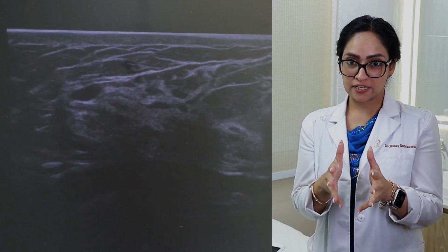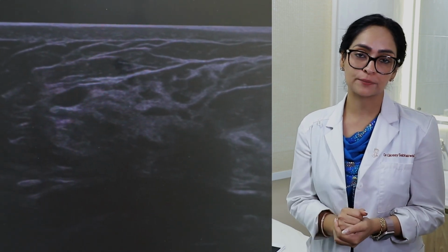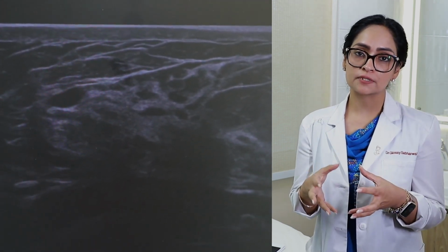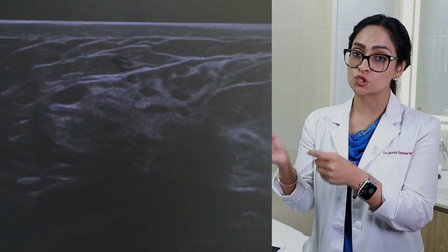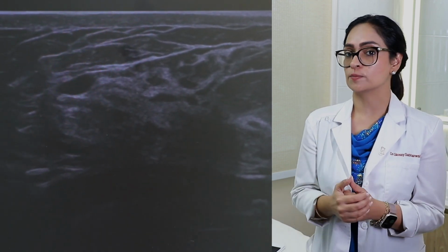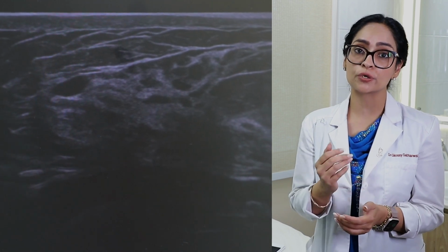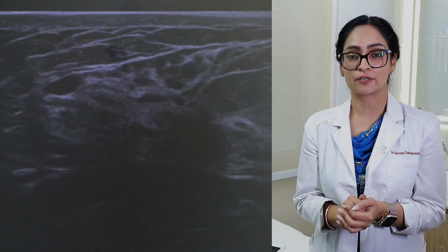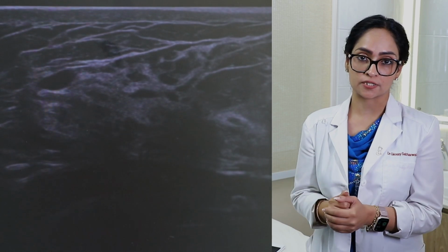Now the next case that we have is of a patient who is 30 years old. Now this patient came to us with complaints of breast lump. Sometimes she is feeling the lump at 11 o'clock position, sometimes it is 2 o'clock position, some months it is not seen. What is it? And it's bothering her. She is just 30. If such a patient is coming to you, what will you do? She is 30, you cannot do mammogram. You will have to depend on your ultrasound skills. So let's see what were the findings in this patient.